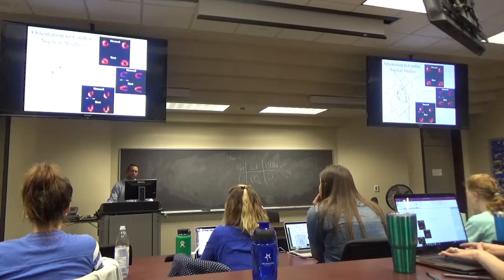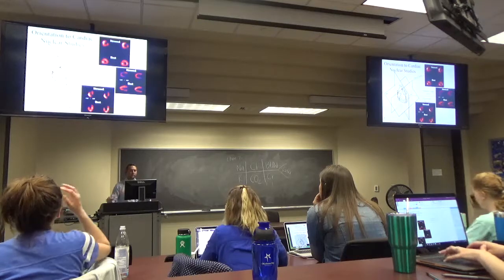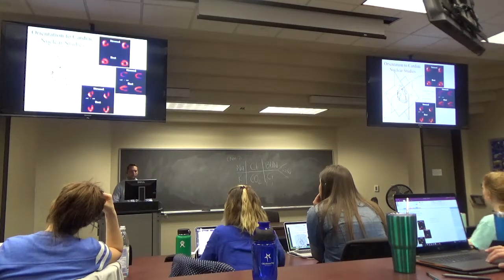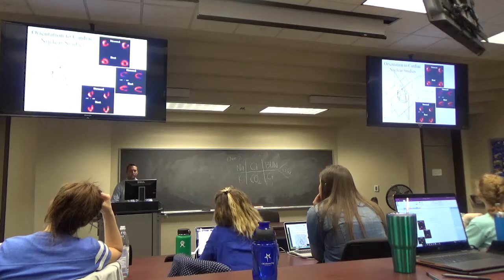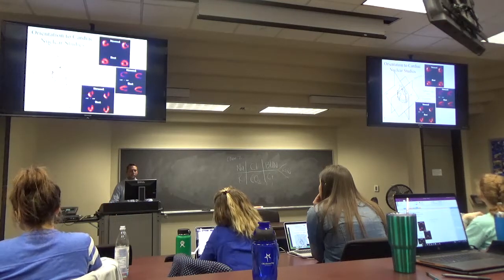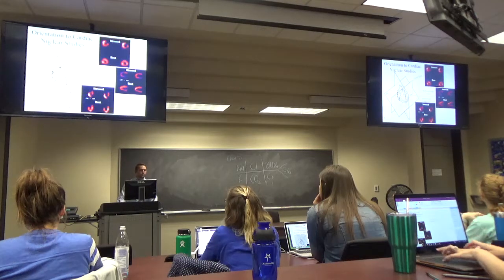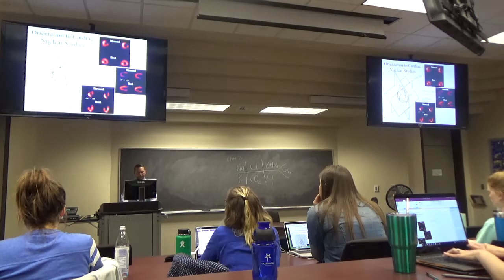From there, if you can find a defect, in this case, you see at rest, very normal, all the way around. Stressed, there's a defect in the heart. So you know that there's an area that's getting ischemic when it gets stressed. That's kind of that scan.